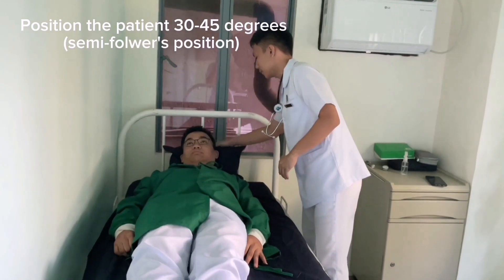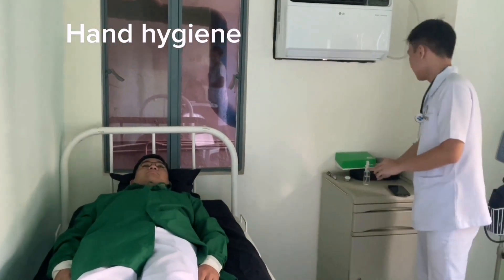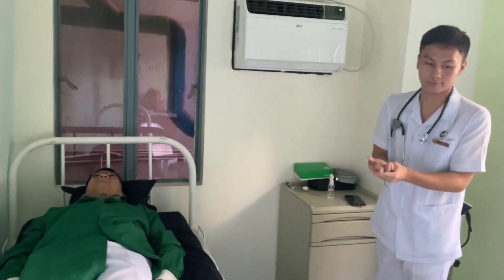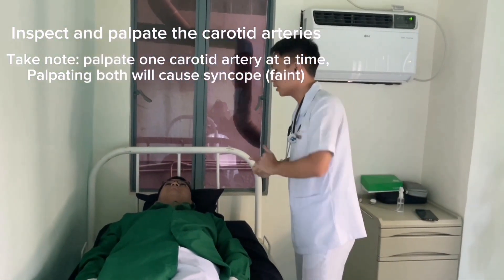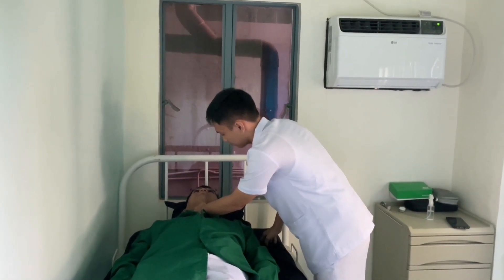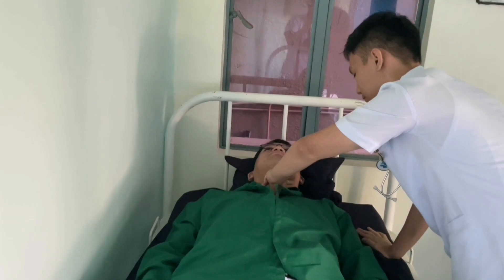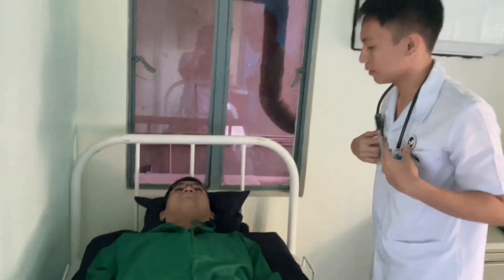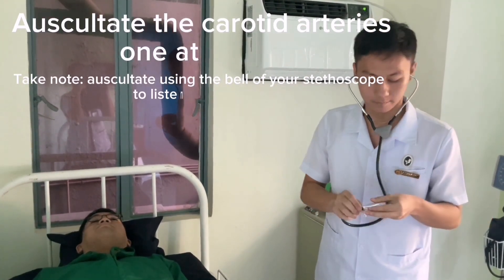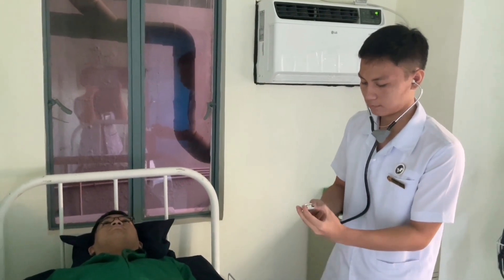Position at 45 degrees. Then perform hand hygiene and don gloves. Inspect and palpate the carotid arteries. Then auscultate using the bell of the stethoscope.